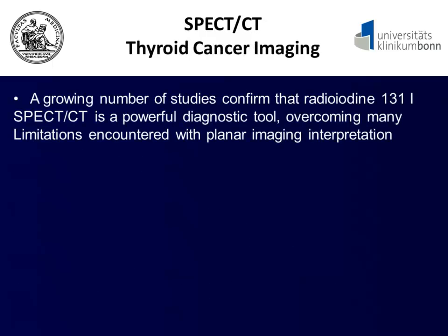Let me start with the utility of SPECT CT in oncology, and first with thyroid imaging. Yesterday we talked a lot about thyroid cancer, and now I'm going to show you the utility of SPECT CT in thyroid cancer imaging.